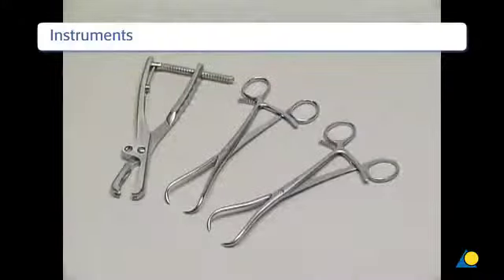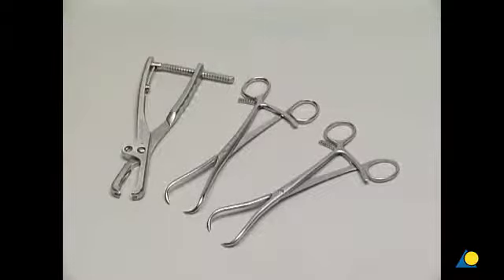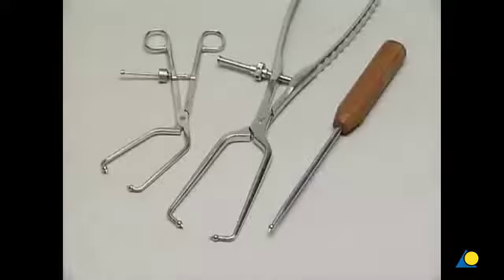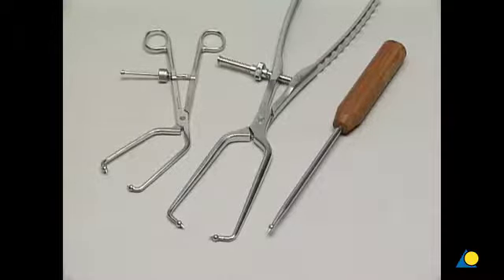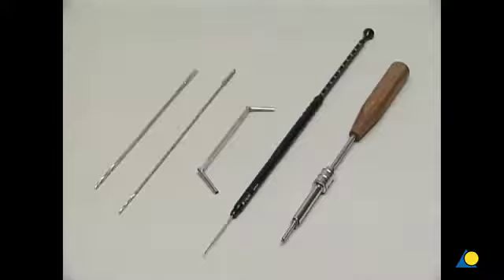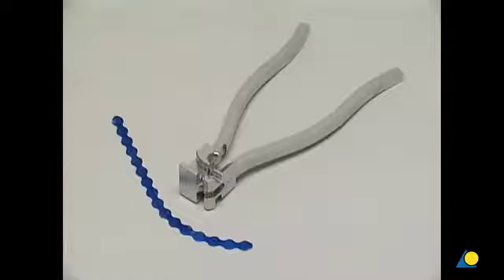The standard instruments for reduction are the Farabeuf clamp and two-pointed reduction forceps. The special pelvic reduction instruments are the angled reduction forceps, the large reduction forceps, and the ball spike. All of these instruments have a pointed ball tip. These instruments from the basic pelvic instrument set are used to insert the 3.5 mm cortex screws. The bending template and the bending pliers are needed to contour the plate.